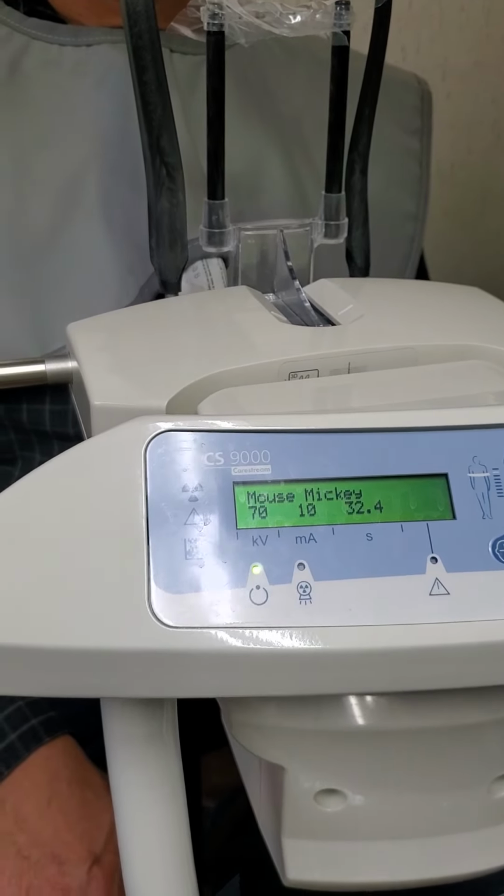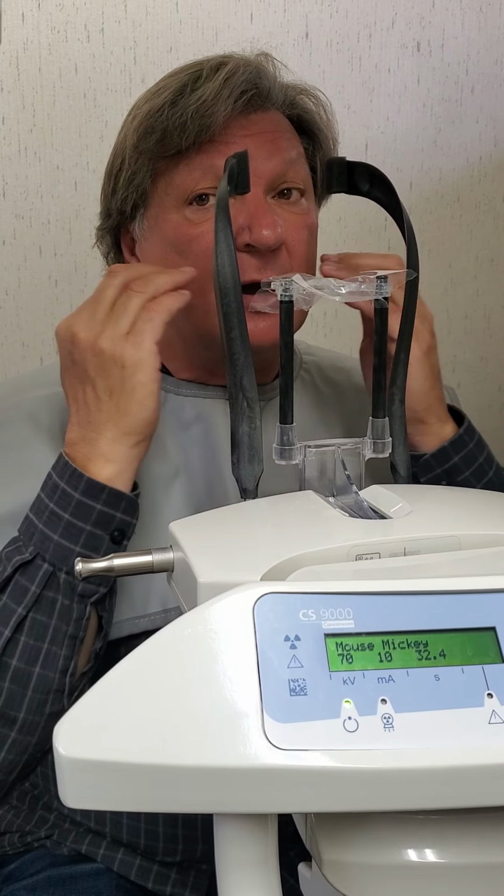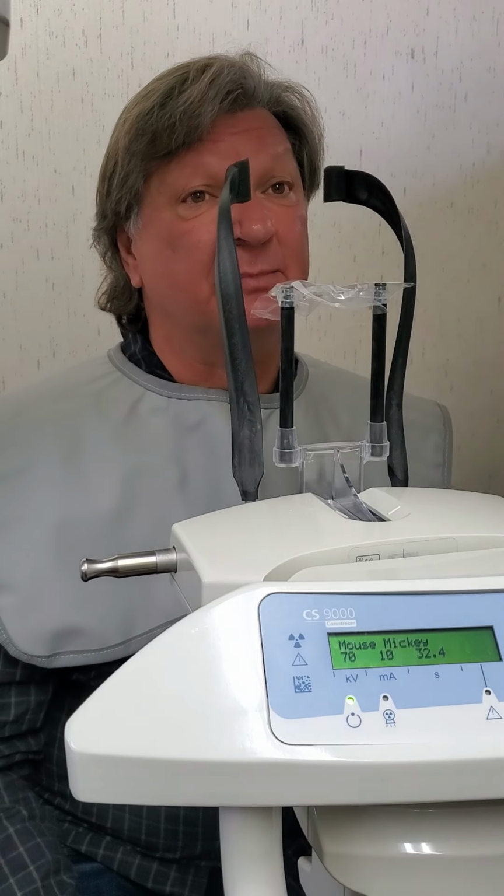Okay, let me talk about that just for 1 second. It's been a huge problem. When we go like this on the X-ray, I'm no longer parallel with the floor, right? So when we take this X-ray and the patient isn't parallel, you'll be missing. This will be below your line. This will be up too high, and so you won't have the occlusal surface. The X-ray is only this big, and when we go like this, these teeth will be missing. Okay, so it's been a big problem to get to where we're parallel. My jaw, my teeth, this thing is parallel with the floor. It is a big deal.